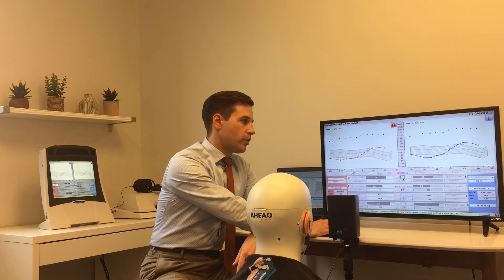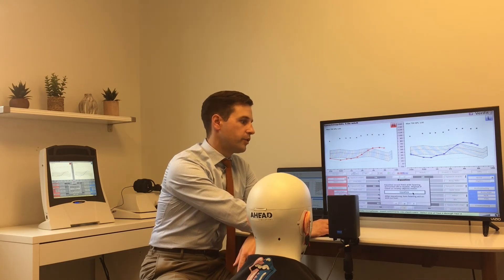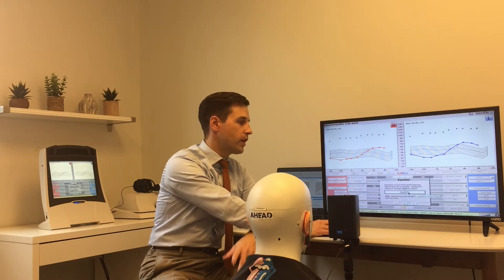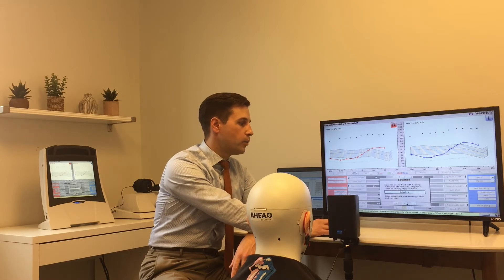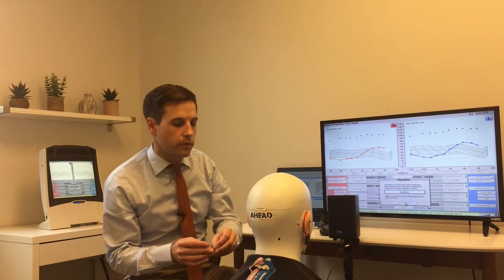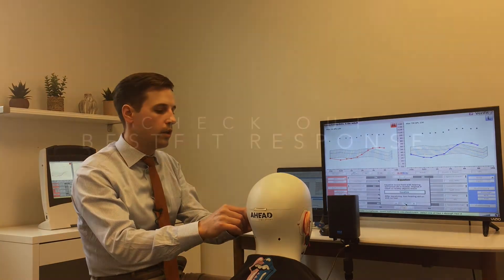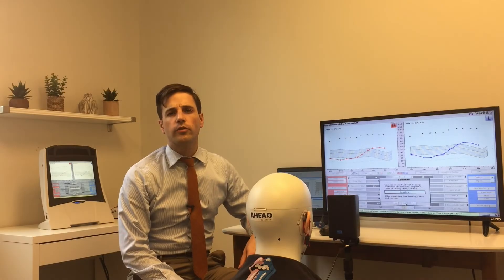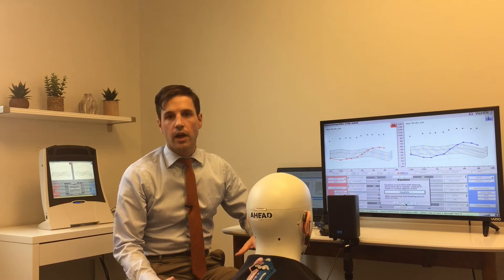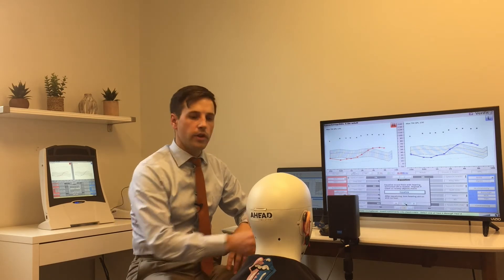If I go ahead and start a curve it's going to pull up the equalization right away. I'm going to keep quiet, stay away from the client, and tell them to be quiet and look straight ahead. Once we've equalized, if we click here it's going to start the measurement. I've got my hearing aids kind of on best fit and ready to go, so I'll insert these here. What I like to do is run a quick curve of the best fit just to see where it's at — how good it is, how bad it is.